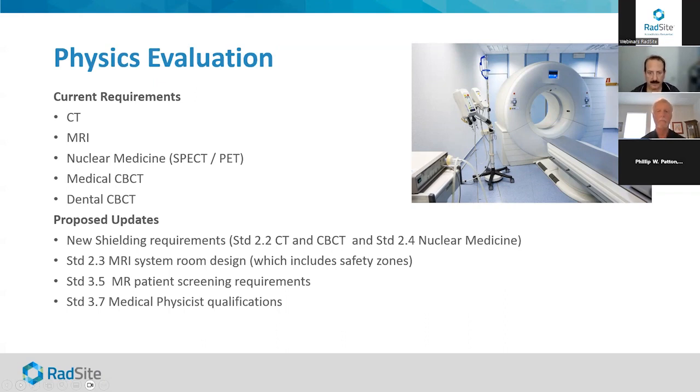And that's in case you're using a site protocol that is not appropriate for a phantom. Like if you're using a propeller type of scan, several of the slices will be unusable from a phantom just by the nature of the protocol. And so we actually have some predefined protocols that you can also submit. So we'd evaluate the site, see if they pass. If they do not, then we'd move to the predefined ones that you submit.